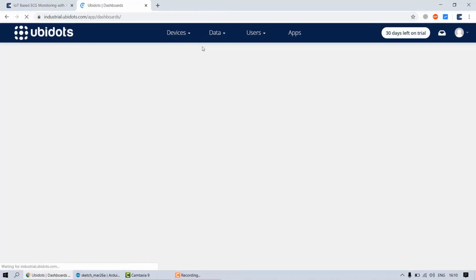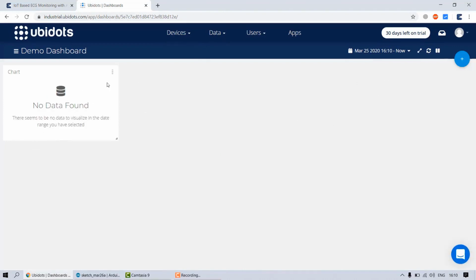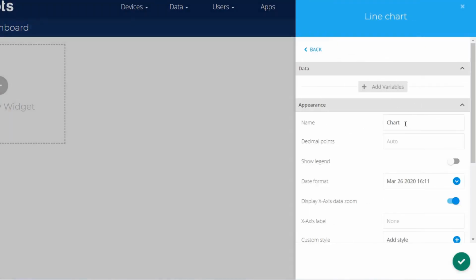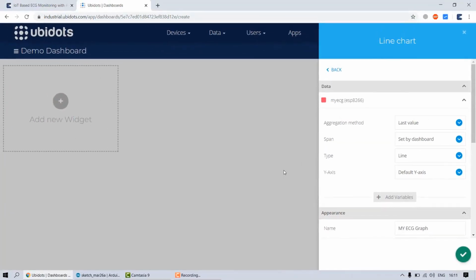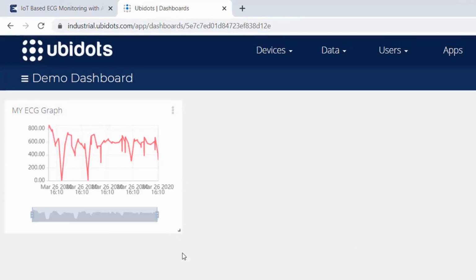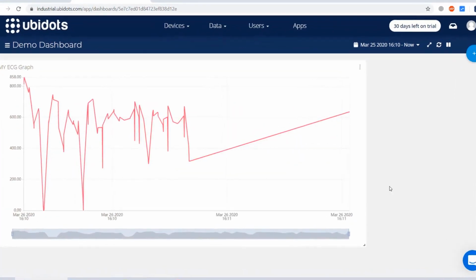Now go to the data, click on dashboard. I just want to delete this chart because I don't need this one. So click the plus sign here, click on line chart and just name it something like my ECG graph, add a variable. So under the add variable, you will get the device name as ESP8266 and myECG. So this has come automatically. Just click on the green tick. So once you click on here, you will get the ECG graph that was seen on the dashboard.